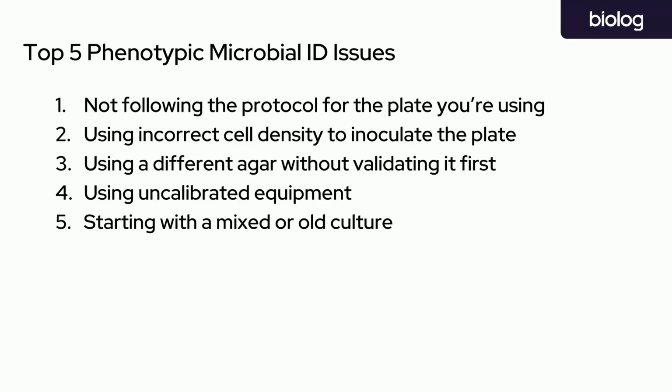Depending on what plate type you have, for instance the YT plates, those 3 rows that have dye in them, the dye is in the plate, not in the inoculating fluid. So the volume in which you resuspend the material dried into the well is really important to get the correct anticipated color development. If you use low volume, the color will be artificially high, so it's important to make sure that your pipettes and other equipment are up to speed on their calibration. Hopefully that makes sense to everybody who works in the lab.